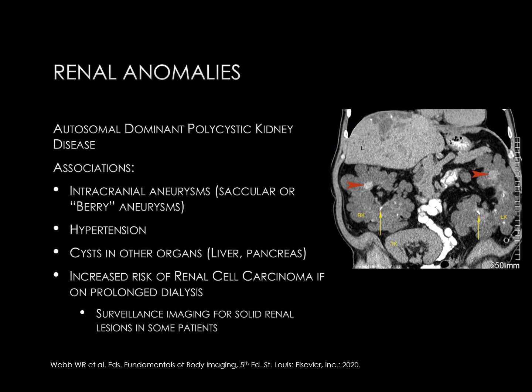At the right side of the slide, we see another non-contrast CT in a patient with autosomal dominant polycystic kidney disease. The kidneys are enlarged and replaced by numerous hypodense cysts. There are several indeterminate cysts which may be hemorrhagic, indicated by the red arrowheads. Renal stones are indicated by the yellow arrows, and there is a transplant kidney in the right pelvis.